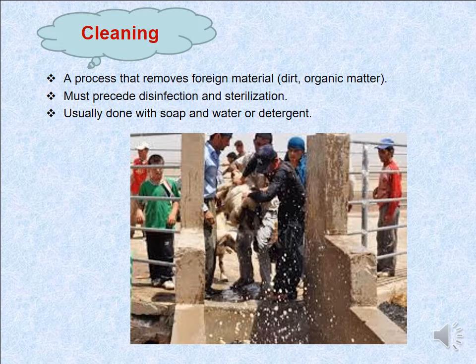We start with cleaning. Cleaning, a process that removes foreign material, dirt, and organic matter, must precede disinfection and sterilization. Cleaning does not remove all pathogenic microorganisms, so after it we must use disinfection or sterilization. It is usually done with soap and water or detergent.